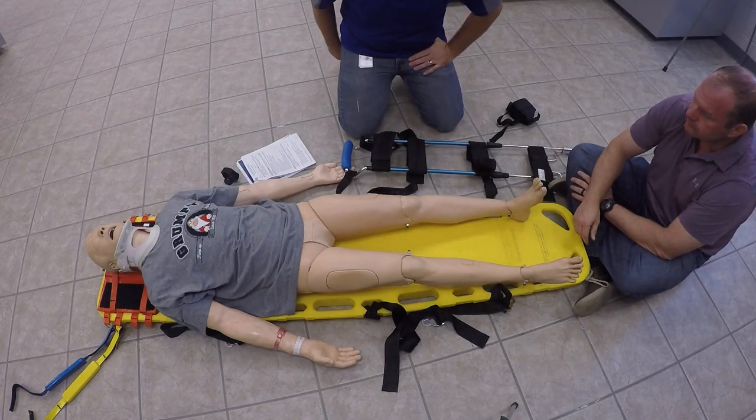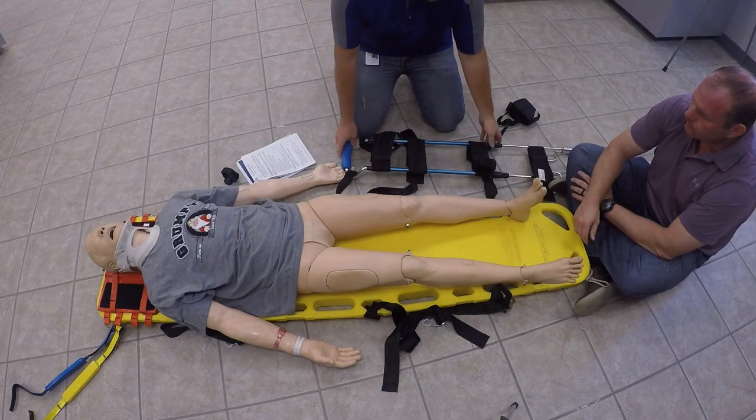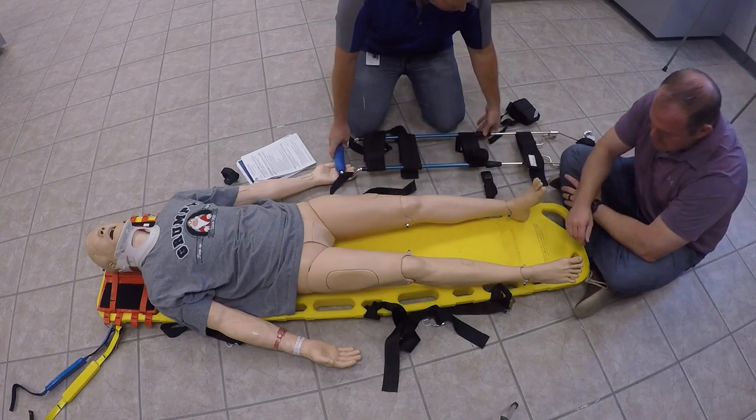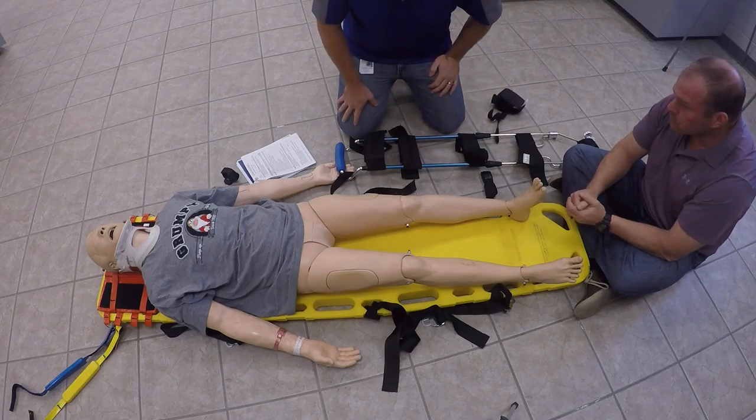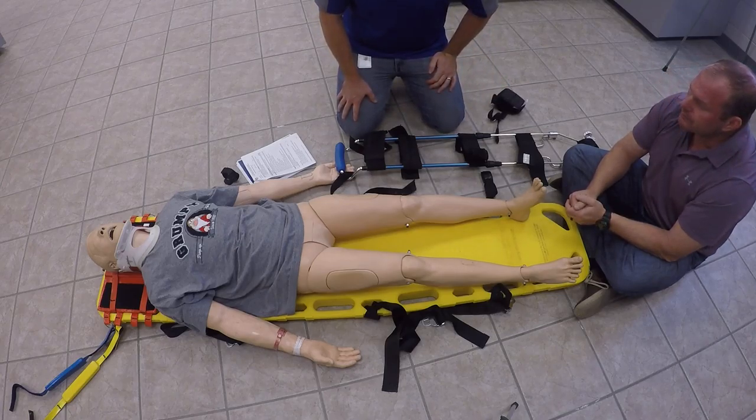This is a traction splint. First thing we're going to do is make sure that we have all of our equipment. We do have a hair traction splint here. We've got four sets of straps on it. We do have our ankle hitch here, and we also have padding material if needed.